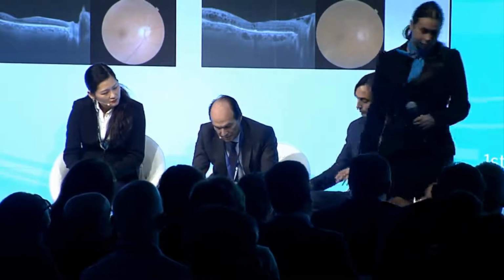Okay. One more question for all the speakers. Do you think that a deeper scan of more than 2.5 millimeters will be of clinical importance in myopia? If yes, what is the limit, 4 millimeters or even more?